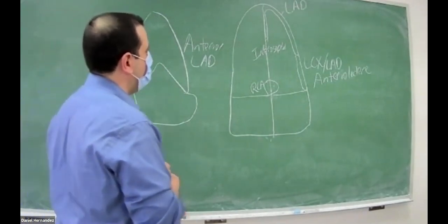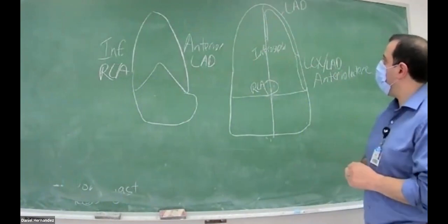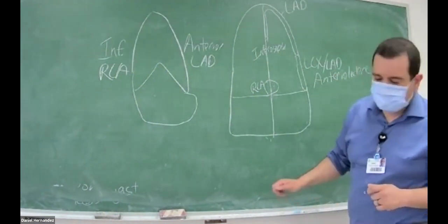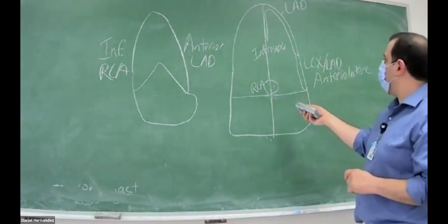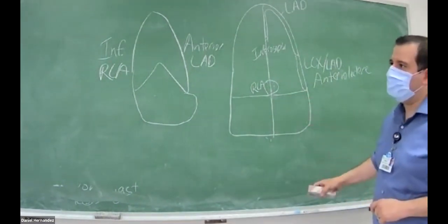In our four chamber, the notch is going to be down, on our heart and the patient lying there. It's kind of hard to picture in four chamber.